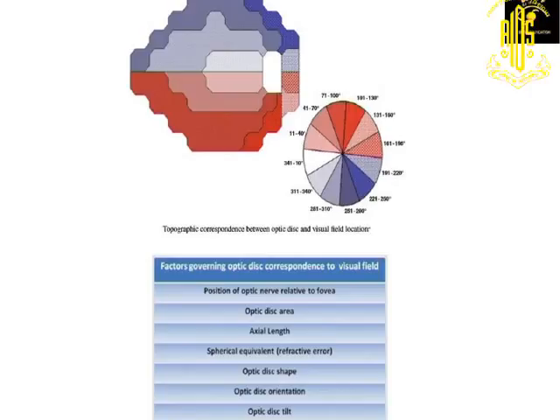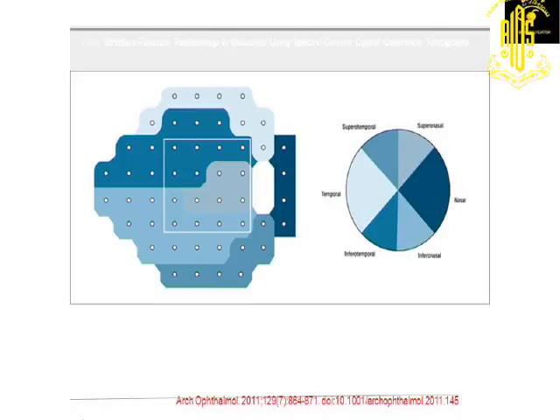So if you have a look at that, it is actually one of my favorite slides because it is so self-explanatory. The colors tell you which area in the disc should give you a clue to what you should look for on the field, or if you see that area in the field, you should look into the disc and correlate the two. So the colors match each other, as you see out here. If you're looking at this area, you match it with this area out here. Similarly, if you're looking at this area, the deep blue, you match it with this area out here. That's how you do it, and this is a very precise chart because it gives you totally degree-wise what to look for. And that's a broader aspect of the whole thing, which is also very self-explanatory.